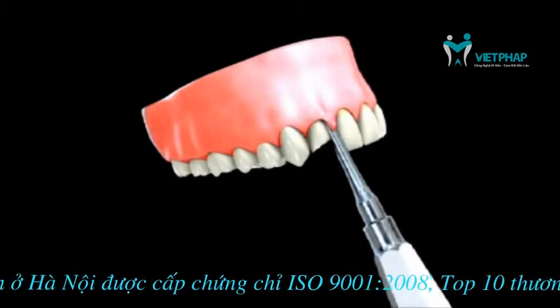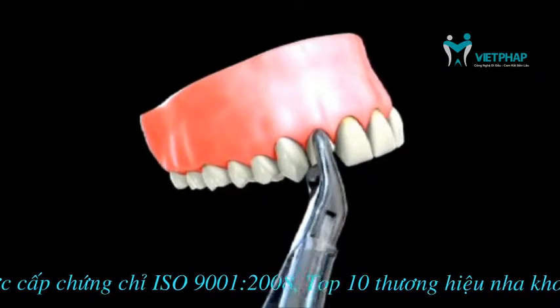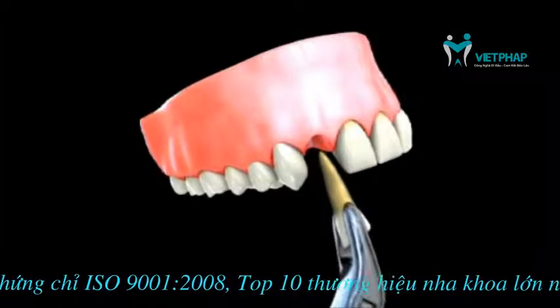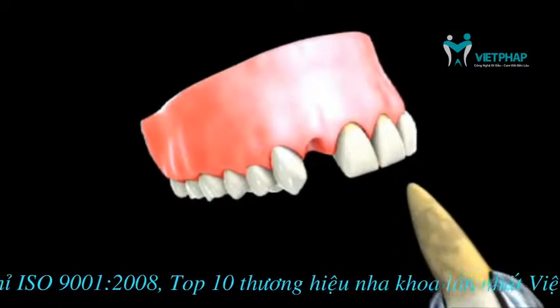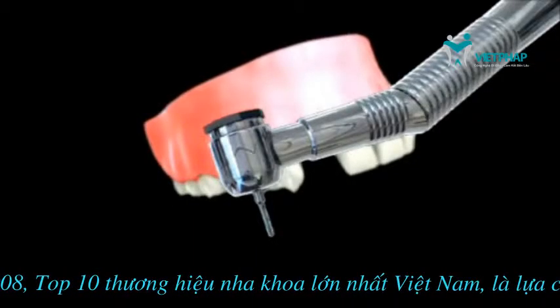A dental instrument, called an elevator, is used to wiggle the tooth in its socket. After the tooth is loosened, it is removed using forceps, or in some more complicated cases, a surgical handpiece is also used to assist with the removal of the tooth.